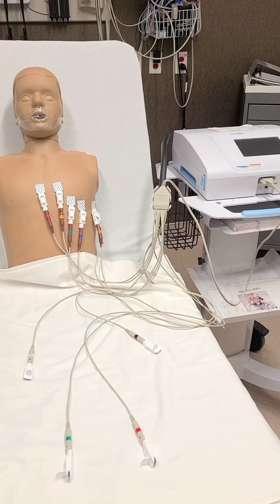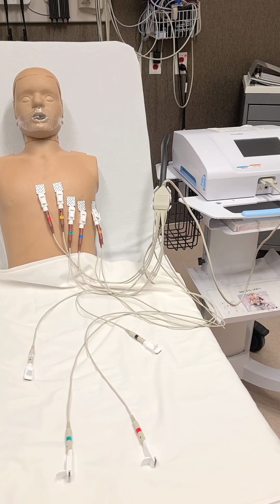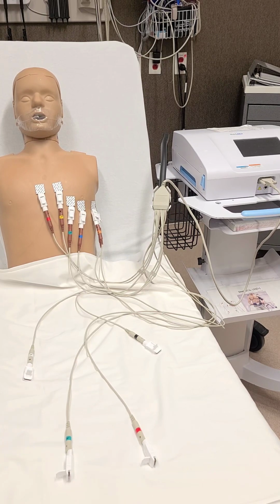Some general considerations: remove excess hair and oils to ensure a good electrode contact. You can use alcohol prep pads for oils and razors for excessive hair. Maintain patient privacy by closing curtains, having visitors leave the room for the procedure, and using a sheet to drape the patient.